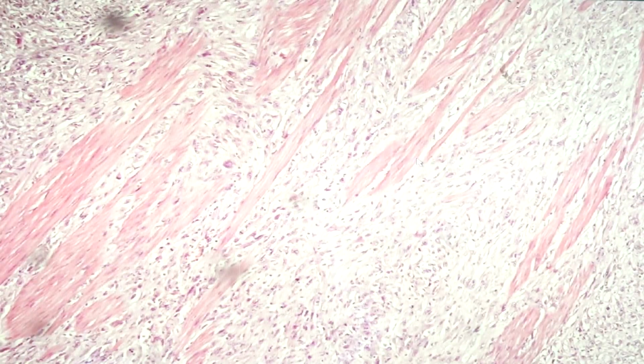Leiomyosarcoma is a malignant tumor that originates from smooth muscle, and one of the clues I would give you is the presence of smooth muscle fibers accompanying this tumor.